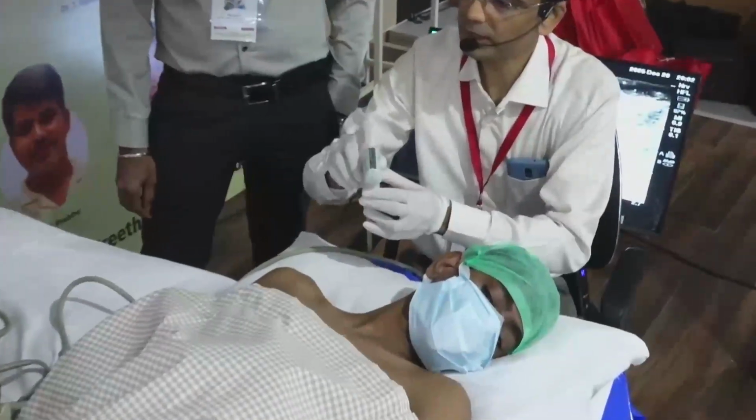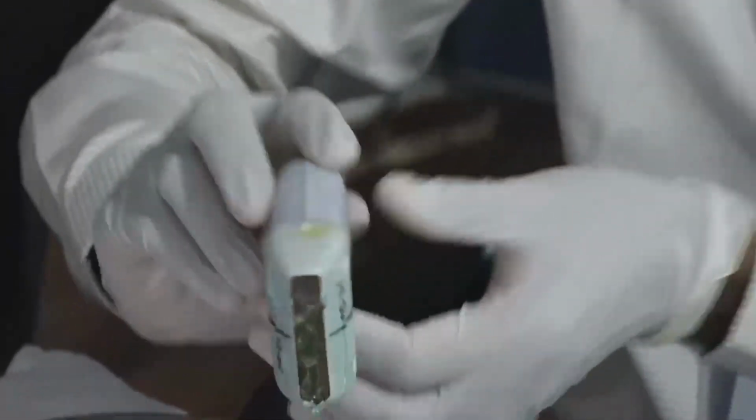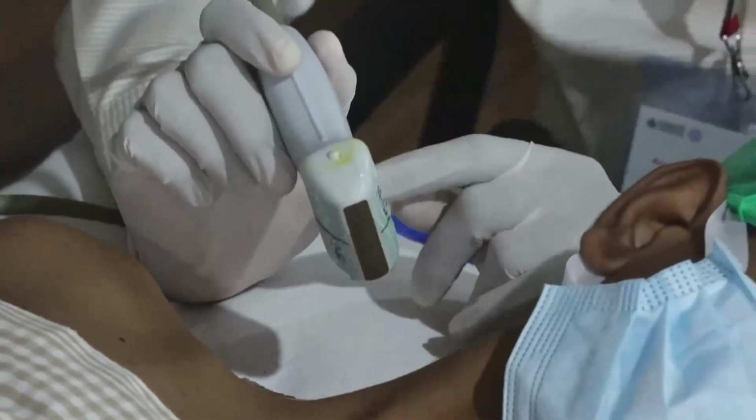So this marker is over the blue area, that is going to be towards the chest. Okay, so now I am keeping the probe. Always, why this root to branch scanning?